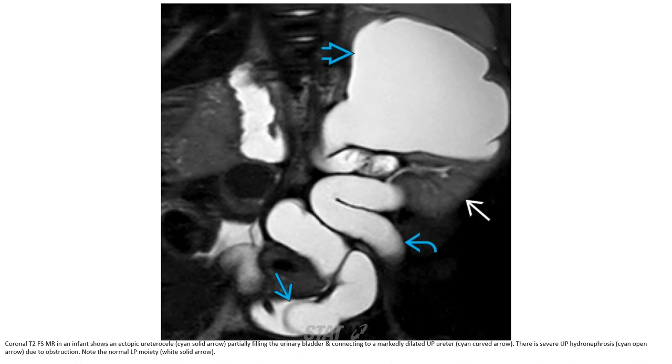T2 fat-saturated MRI in an infant shows an ectopic ureterocele partially filling the urinary bladder and connecting to a markedly dilated upper pole ureter. There is severe upper pole hydronephrosis due to obstruction. Note the normal lower pole moiety.